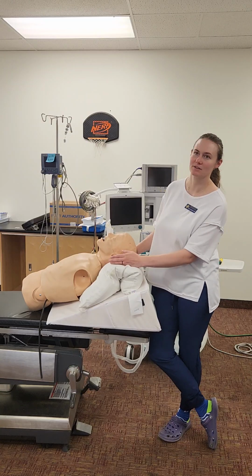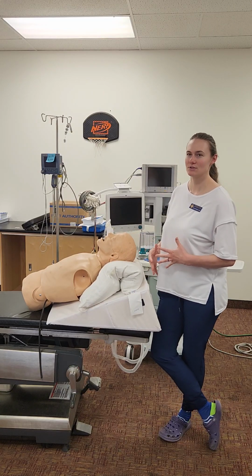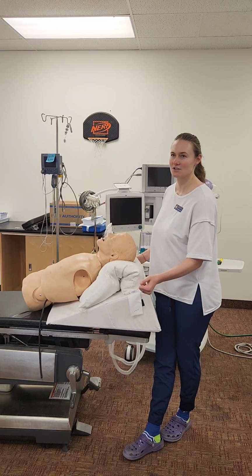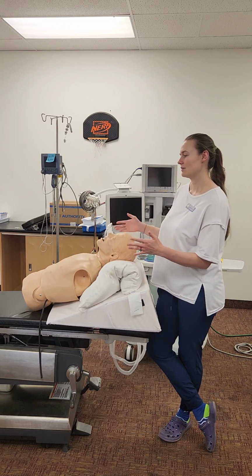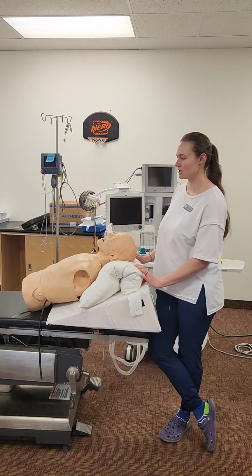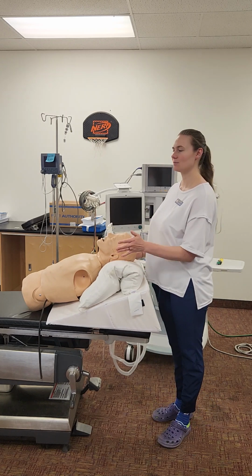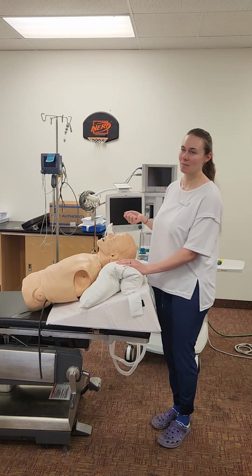He's supine, he might be left tilted, he might be in reverse Trendelenburg, just to whatever view the surgeon wants he's going to be. And if the surgeon's okay with him being ramped, then we're going to leave these here, but if not, we can adjust these as needed. So then I'll pad my pressure points, so my elbows, my heels, his head sometimes. I'll make sure that he had a bear hugger on his butt before this, and then with the procedure we'll go through.